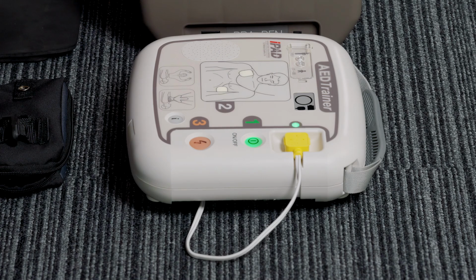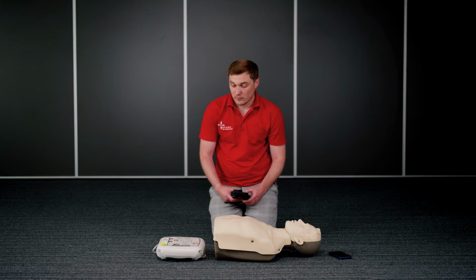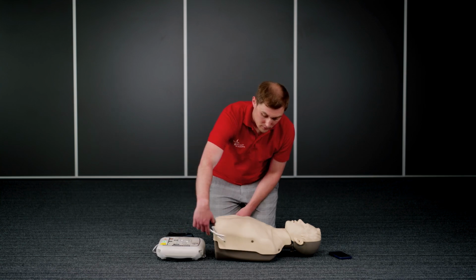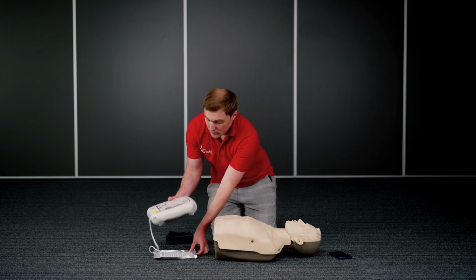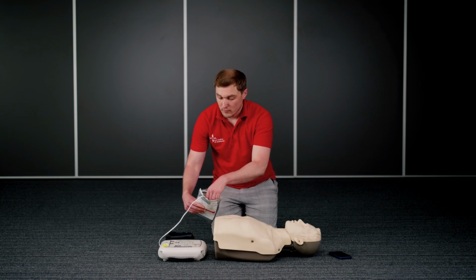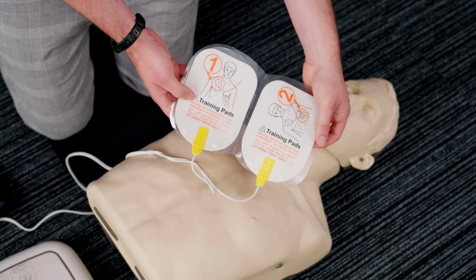Call emergency medical services now. Adult mode. Follow the voice prompt calmly. Remove all clothing from chest and stomach. Rip clothing if necessary. Take out the pads from the bottom of the device. Tear open the pads packaging. Look closely at the picture on each pad.